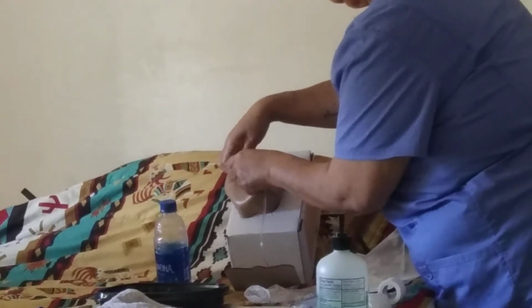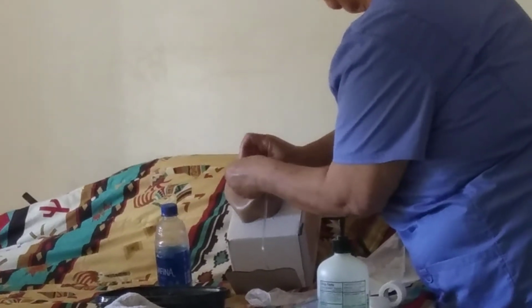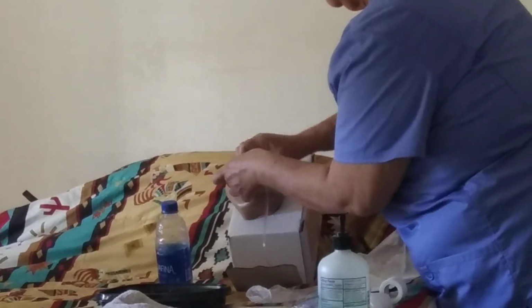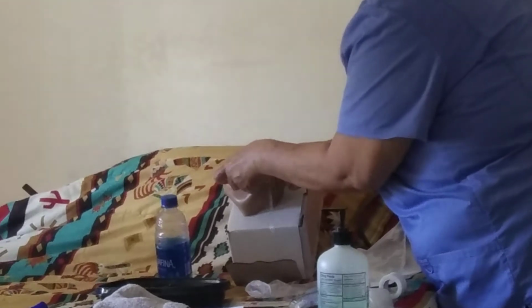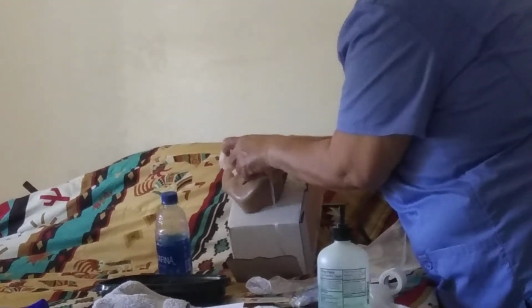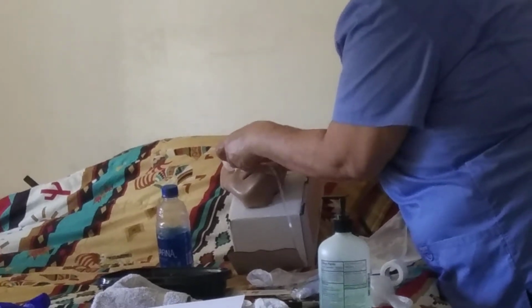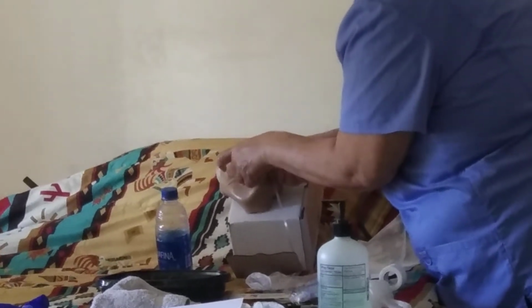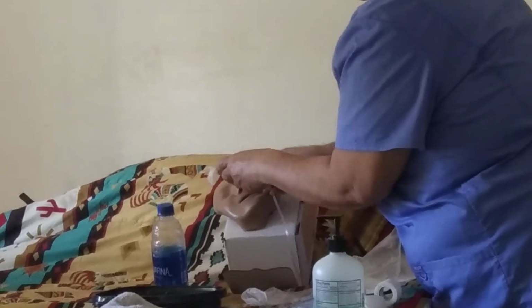And also I'm doing this one, I'd remove this piece. Wrap it around. Then I take the other piece and go the opposite direction.